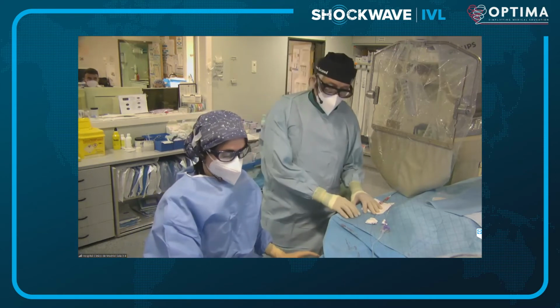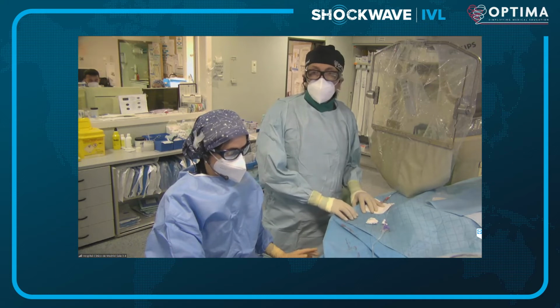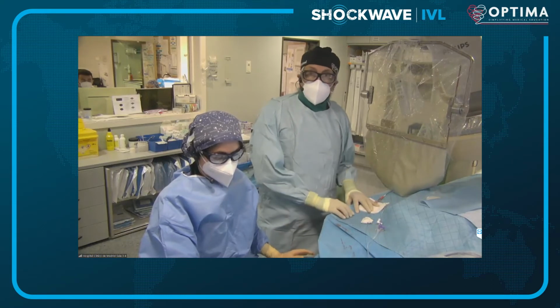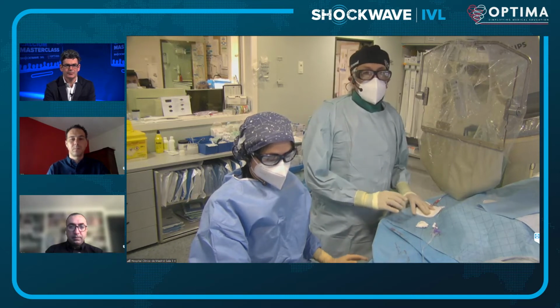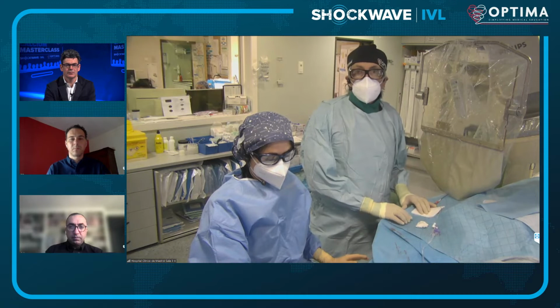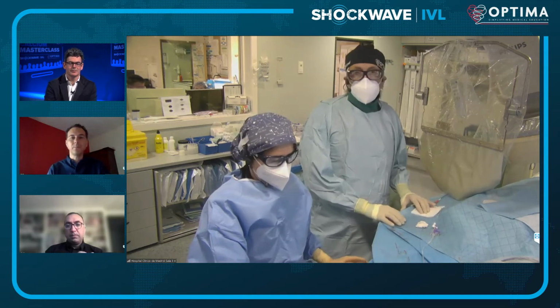Absolutely. So let me first clarify that for the time being, treatment of unprotected left main stenosis with shockwave is an off-label indication that we have to gauge in specific patients. And as you mentioned, in Europe, we have gathered already some evidence that is supporting that it's very safe. This is a case of an unprotected left main huge calcification, as typically happens in many patients who have previous CABG. And the lessons that we have learned is that in the left main environment, you have distinct advantages of lithotripsy over other atherectomy techniques, particularly related to the size of the vessel, the fact that you can use a device that is 4 millimeters in diameter to prepare your plaque.